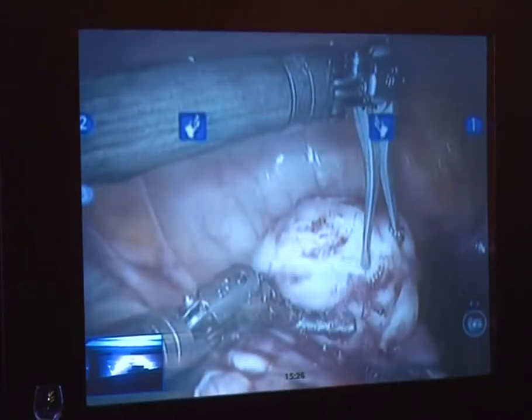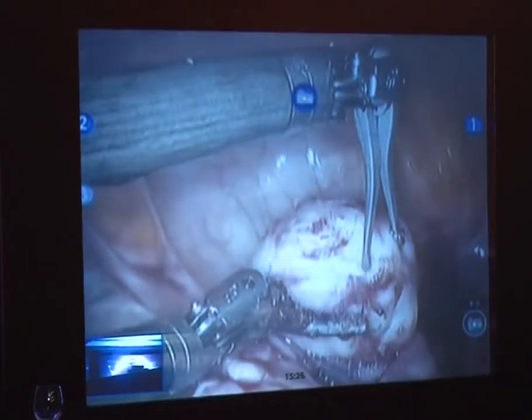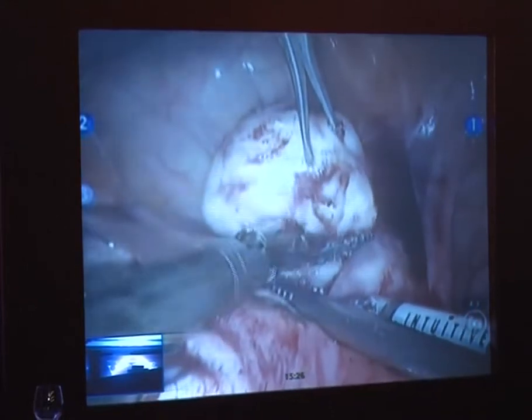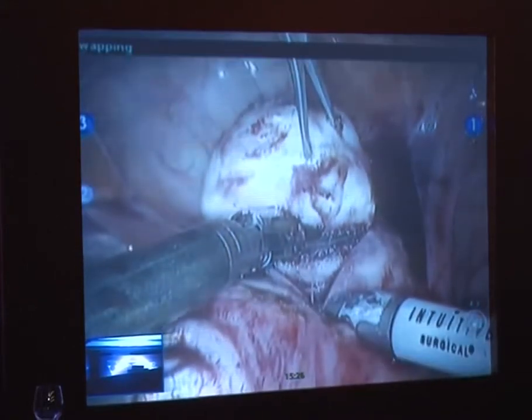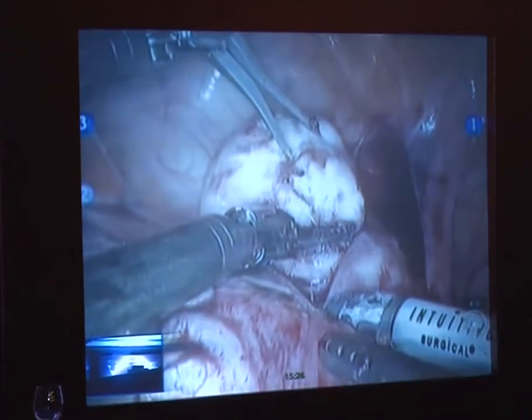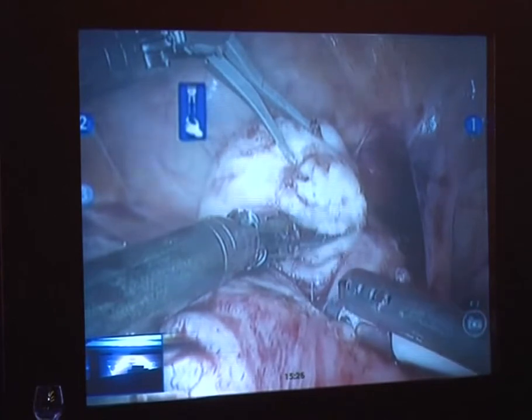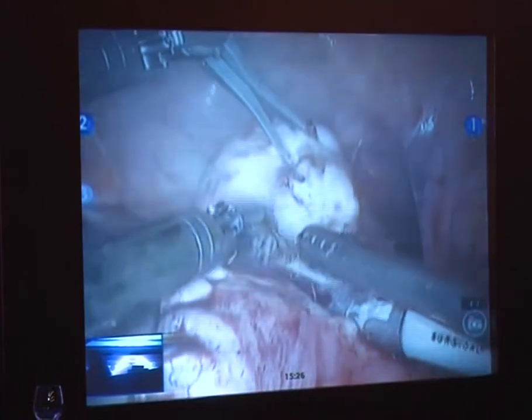Suction in there. There's a major vessel right there. I think that's something that might have been feeding the myoma. And this is very superficial, this one. That's going to have a lot to close.